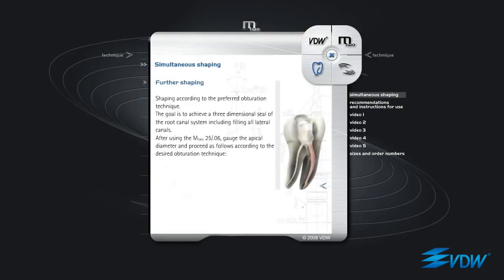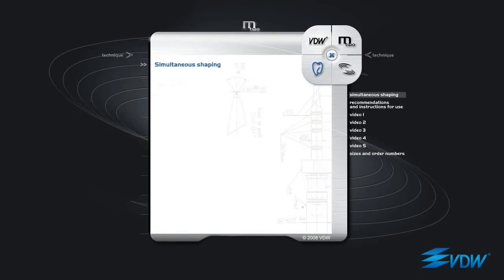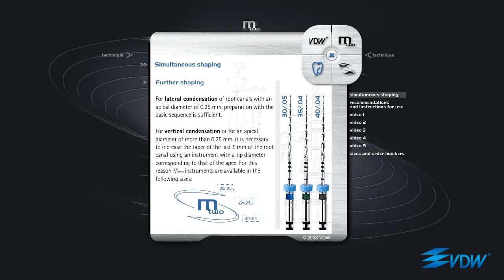Further Shaping. Shaping according to the preferred obturation technique. The goal is to achieve a three-dimensional seal of the root canal system, including filling all lateral canals. After using the M2 25 06, gauge the apical diameter and proceed as follows according to the desired obturation technique. For lateral condensation of root canals with an apical diameter of 0.25 mm, preparation with the basic sequence is sufficient. For vertical condensation or for an apical diameter of more than 0.25 mm, it is necessary to increase the taper of the last 5 mm of the root canal using an instrument with a tip diameter corresponding to that of the apex. For this reason, M2 instruments are available in the following sizes.